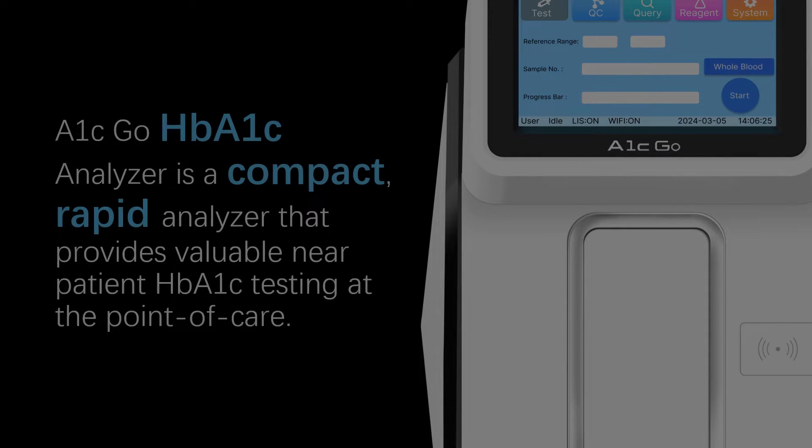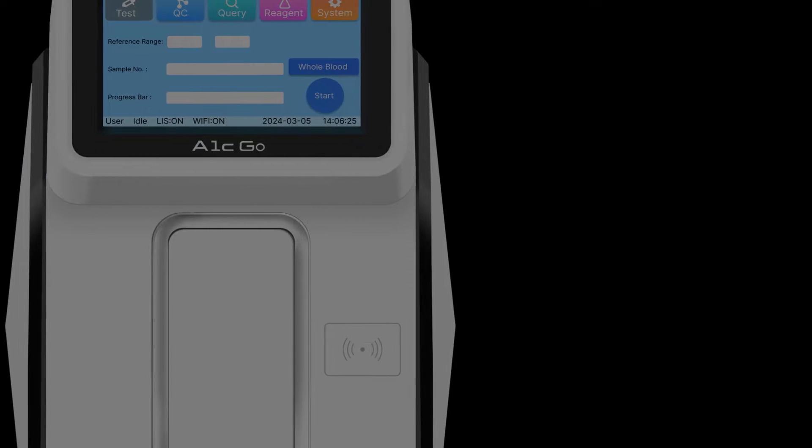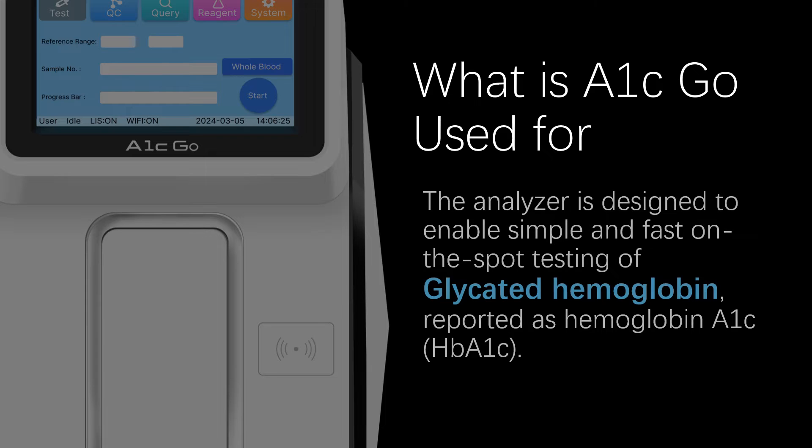The A1C Go HBA1C Analyzer is a compact, rapid analyzer that provides valuable near-patient HBA1C testing at the point of care. The analyzer is designed to enable simple and fast on-the-spot testing of glycated hemoglobin, reported as hemoglobin A1C.